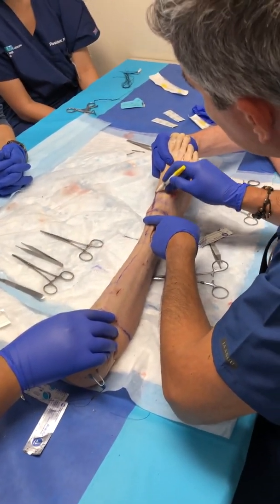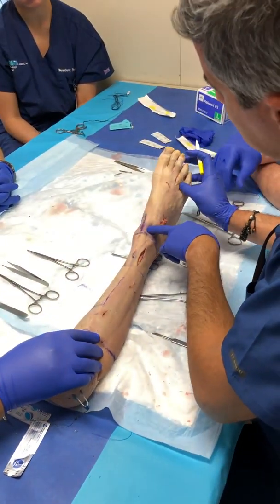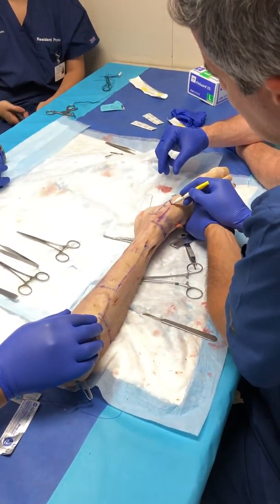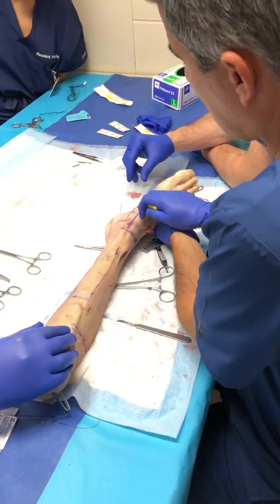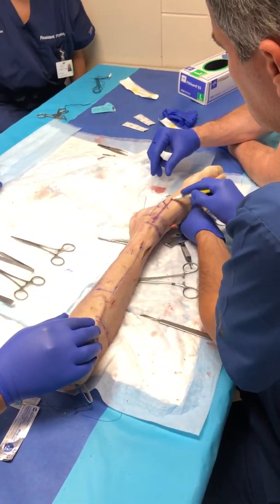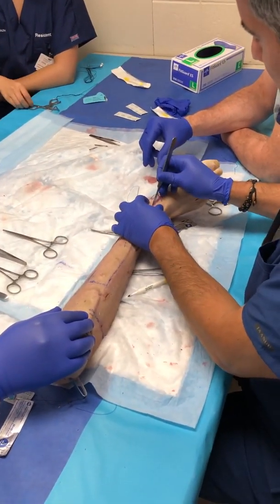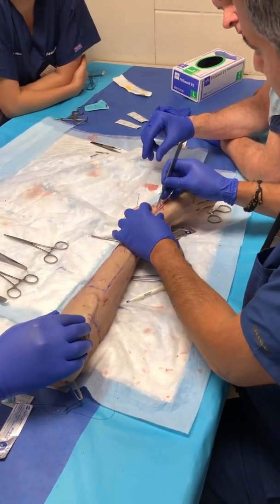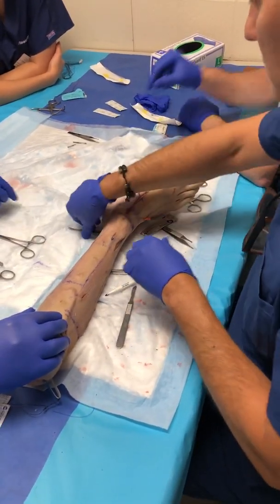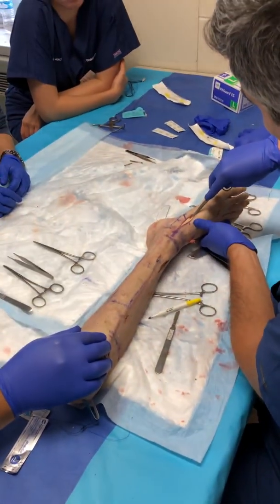So you can see right there, okay? So we're gonna make our incision, not at the level of the ankle, sorry. We're gonna go at the same level of the navicular, but up. That's how I always remember. Right here in this area, okay? So let's do it. So we're gonna make our first incision. And you can see that it's obvious that it's there. Okay. So you open the sheath.